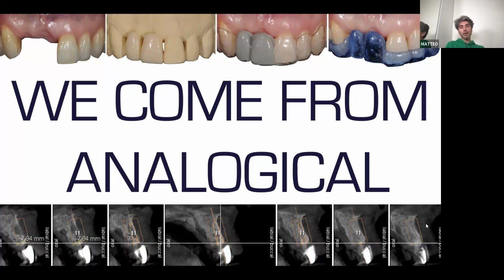Then we have always planned the restoration first by doing the wax up analogically and duplicating the shape of the wax up with a radiological guide.